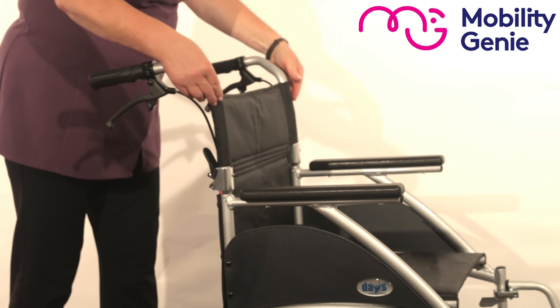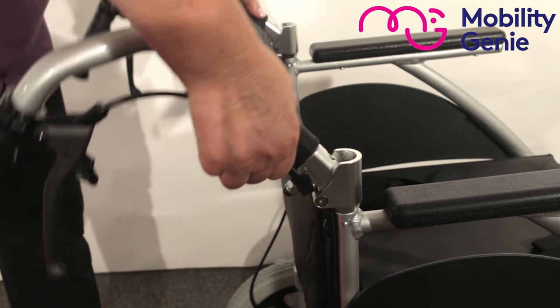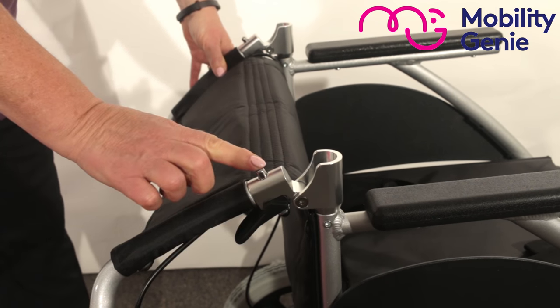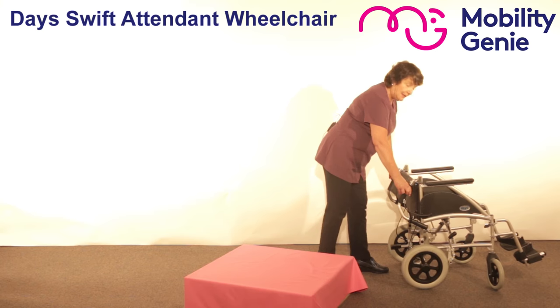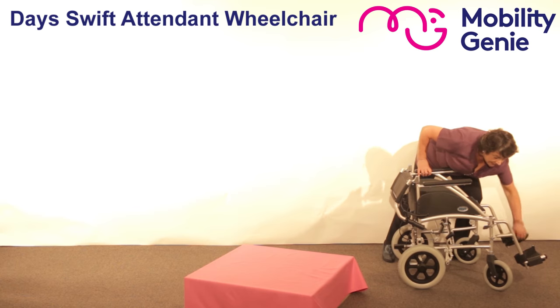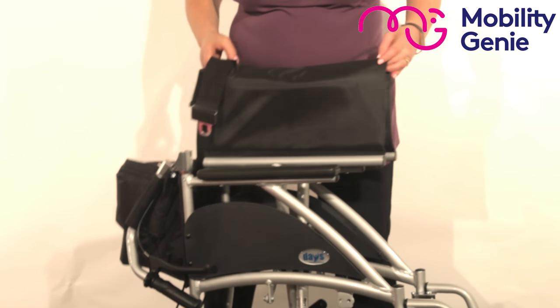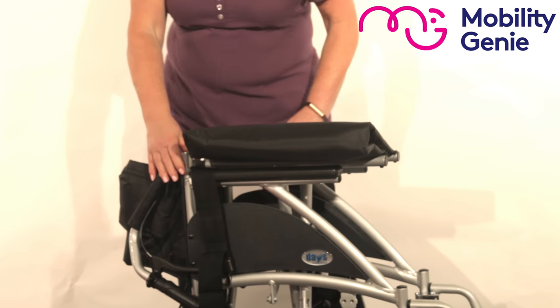As you go down the arms of the wheelchair you can see that you've got two little handles at the back, and that's to allow you to fold down the back. That's particularly useful when you're putting it in and out of the car or when you're storing it, because it just makes it store nice and easily.